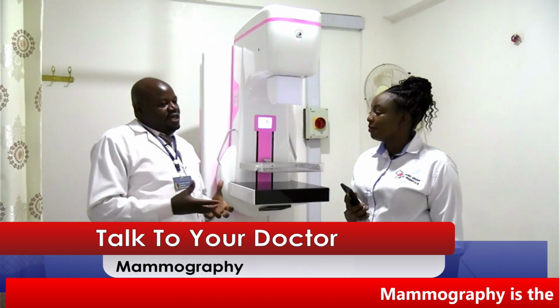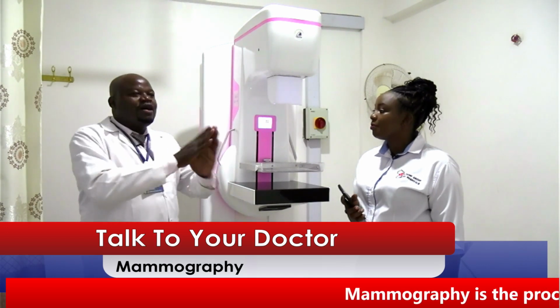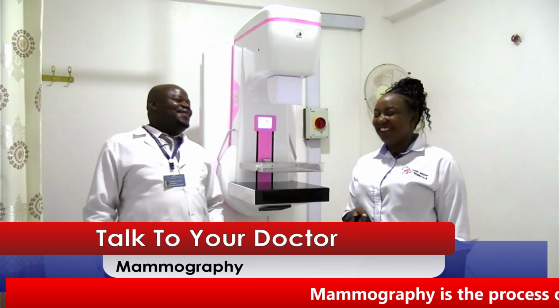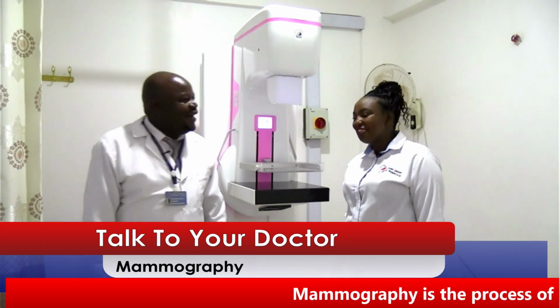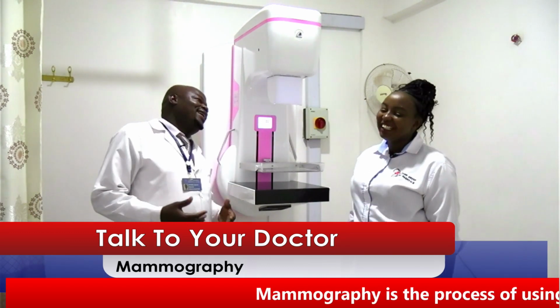So we have to make sure that if you're coming for the procedure, you don't have those implants. If they are removable, you can even remove them.